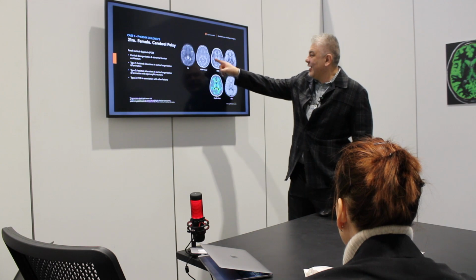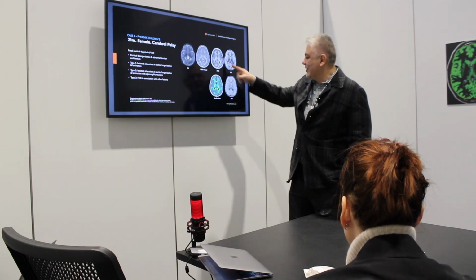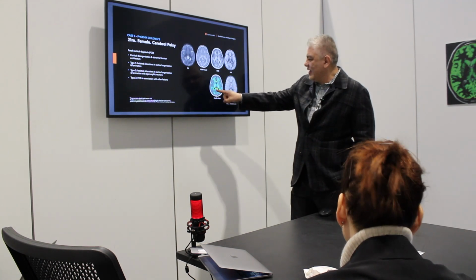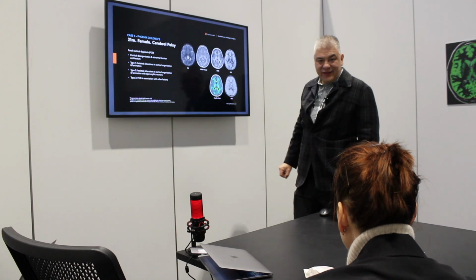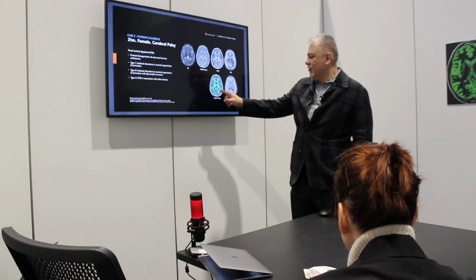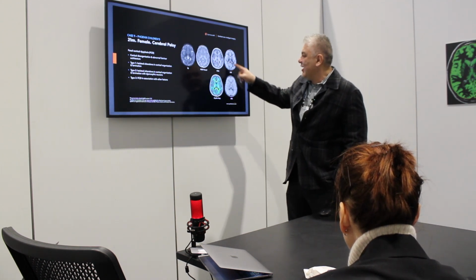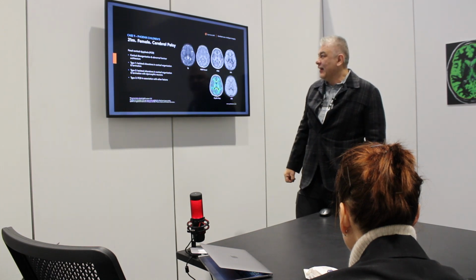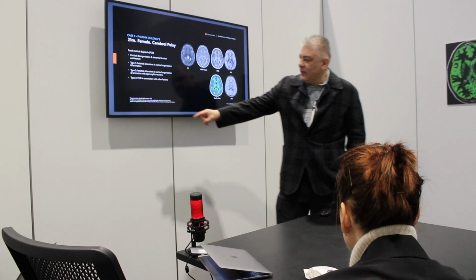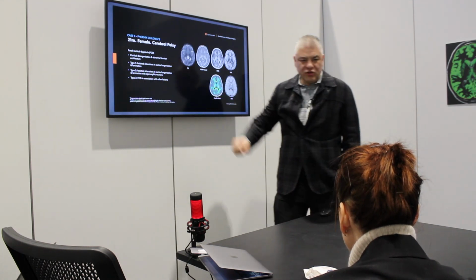Well, how about this cortex here? How about how bright the cortex is here and here, and how much the myelin is decreased in this area compared to this area? So the occipital here versus here, the myelin volume is significantly low. So there is a significant area of cortical dysplasia here on the right occipital that is associated with a developmental venous anomaly.